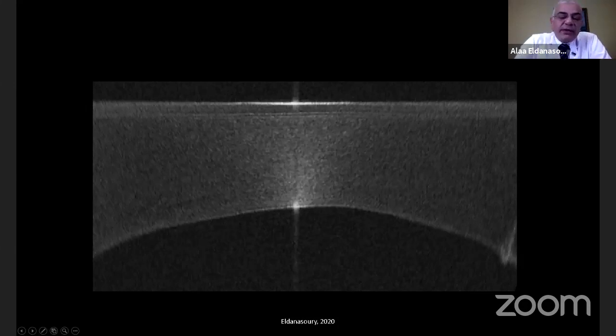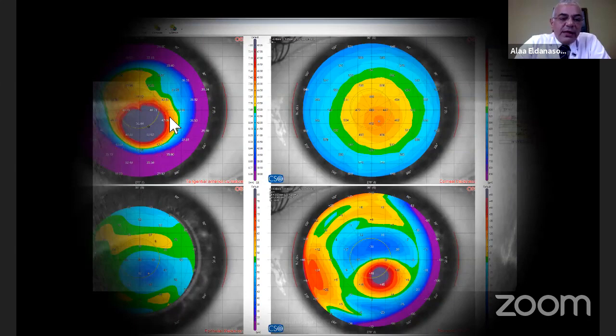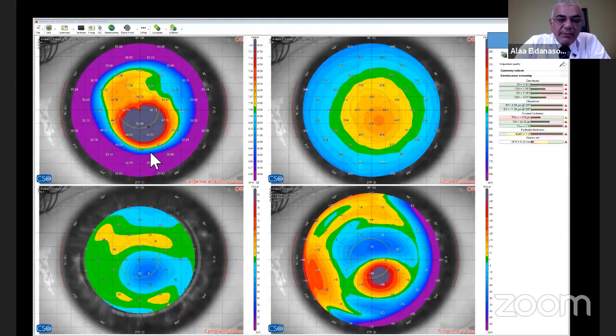Now, this is a map of a typical keratoconus patient. So if you have a typical keratoconus, what are you going to see? You're going to have focal anterior steepening on the anterior map. You're going to have the same thing on the back surface of the cornea, a posterior elevation, which is very clear. And this is a moderate or even an advanced cone. The corneal thickness will show thinning at the area of the steepening and the posterior elevation. And you will have thinning of the epithelium on the epithelial map. Now, this is a clear keratoconus patient. This does not represent any clinical challenge.